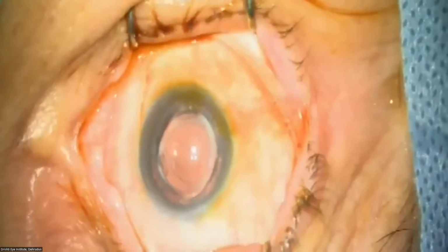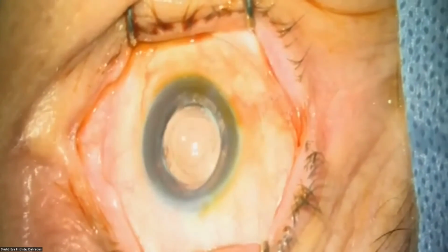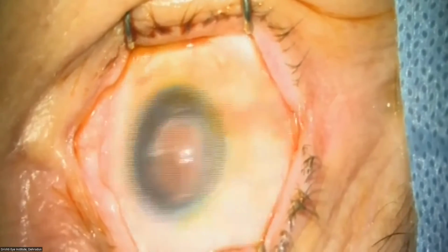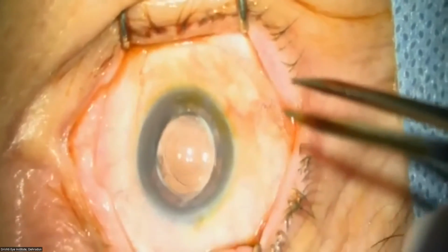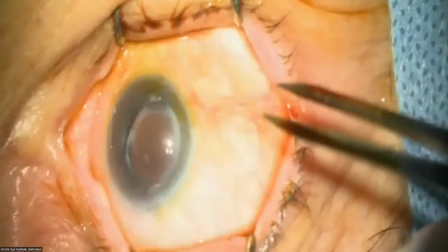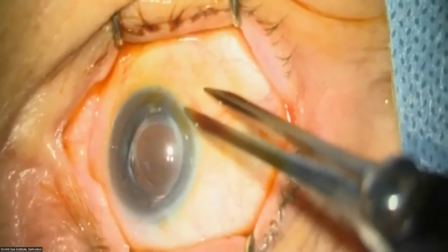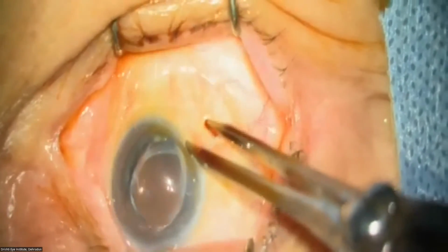I usually prefer the inferotemporal quadrant for injection, and it's a phakic eye. I mean, sorry, it's a pseudophakic eye, so I can use 3 millimeter also. So 3 millimeter is the preferred marking for me with the calipers.